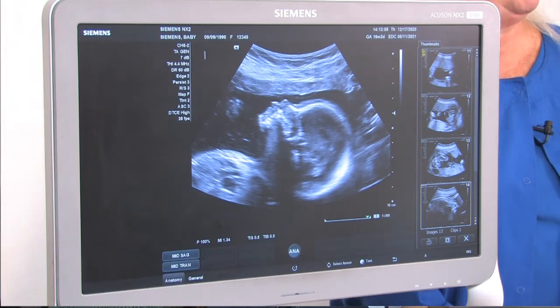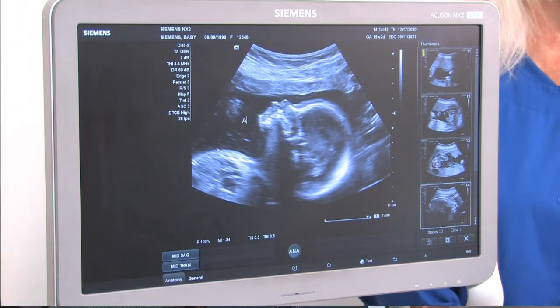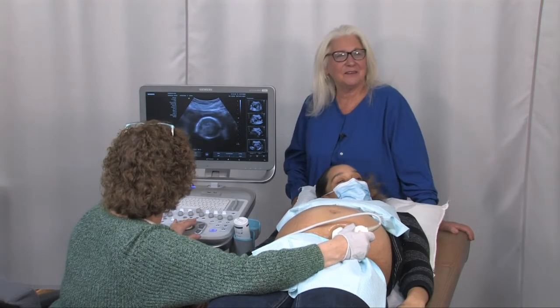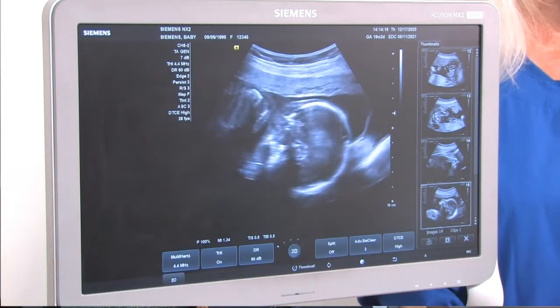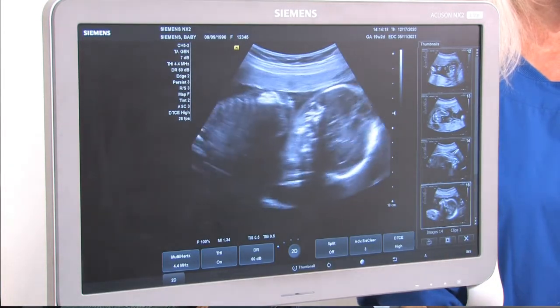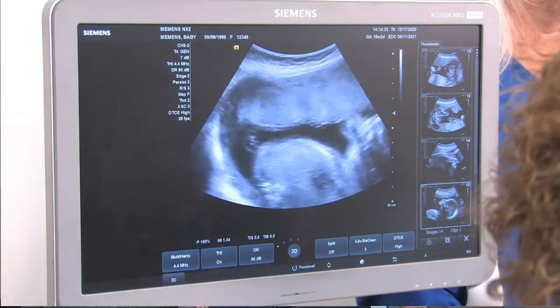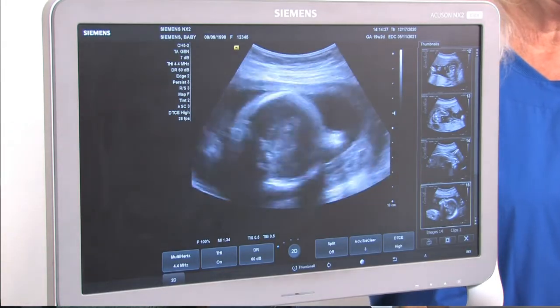That is baby A with its face up, the chin, the nose. Oh, that's perfect. Right, twin A. Oh, you got twin A on that one. Yeah, you have to come in at the right angle. Now this baby, they're actually looking at each other. Oh, that is so cute. Like, what are you doing, sister?